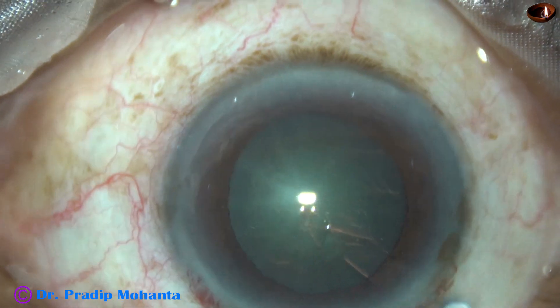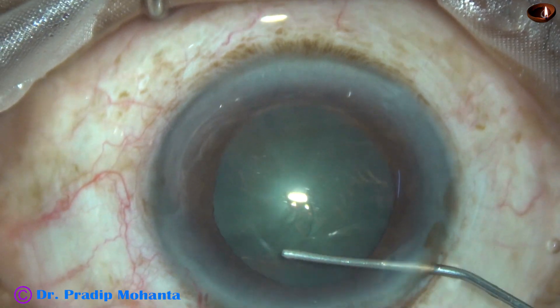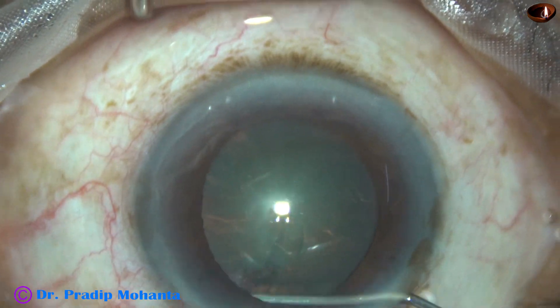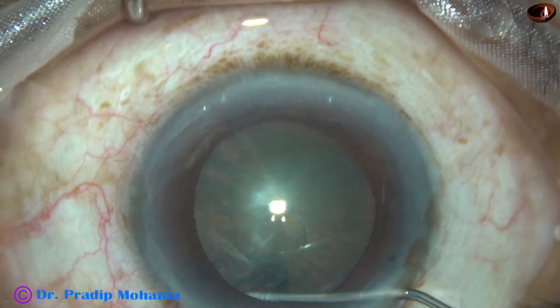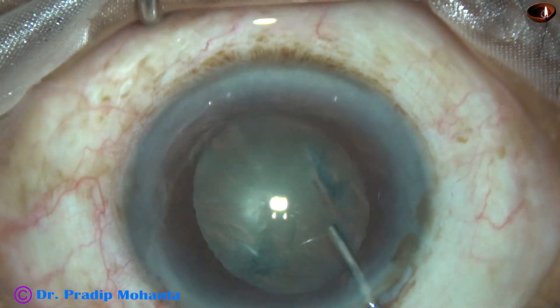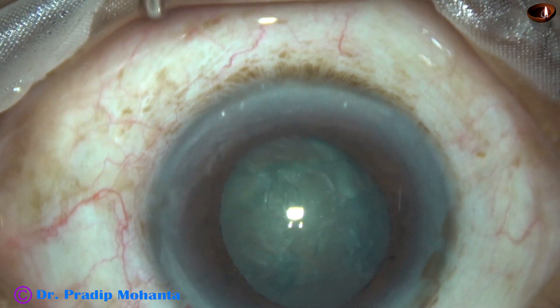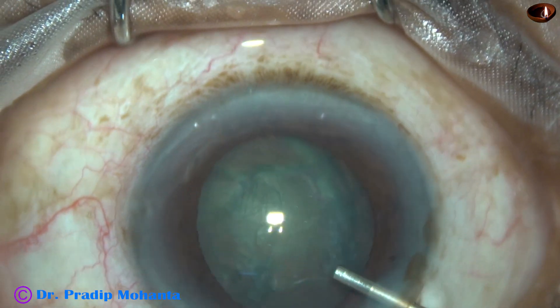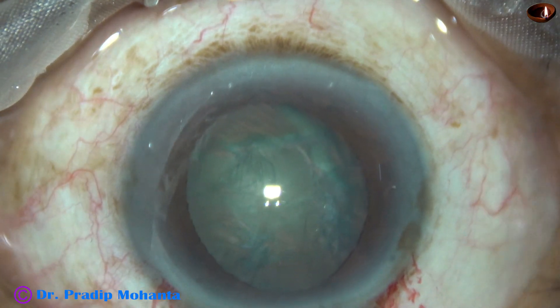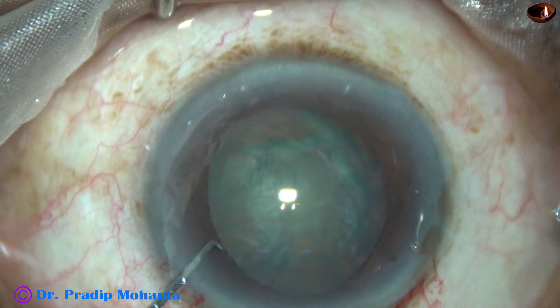Now, hydrodissection. A 27-gauge cannula and balanced salt solution is being used to do hydrodissection. At this time, I could make out that the iris is floppy. The pupil is getting small, and I know that this floppy iris is going to cause some problem. Now, see what happens as I try to chop this nucleus.